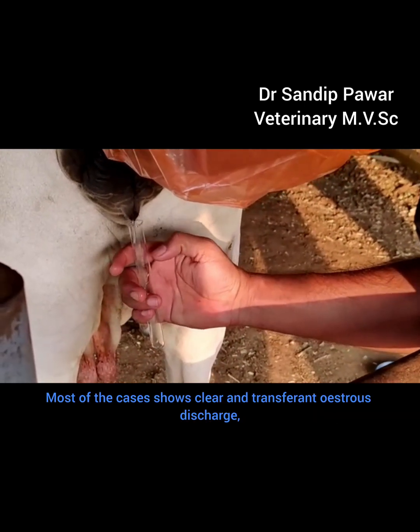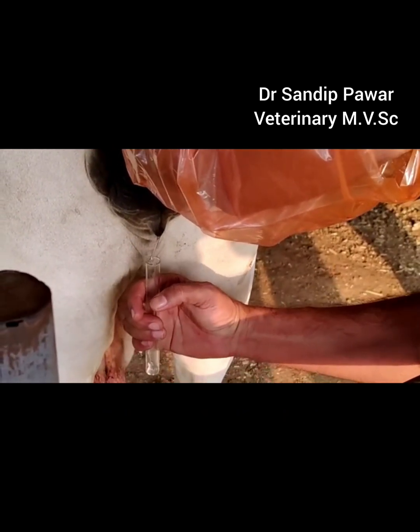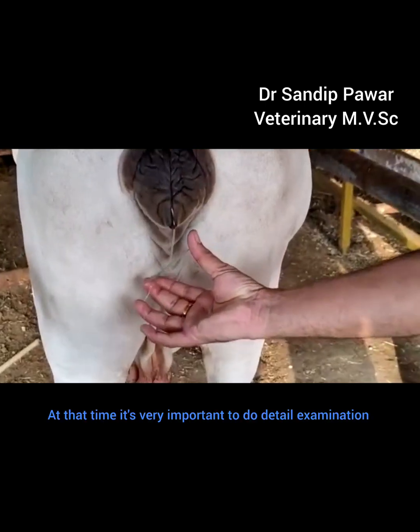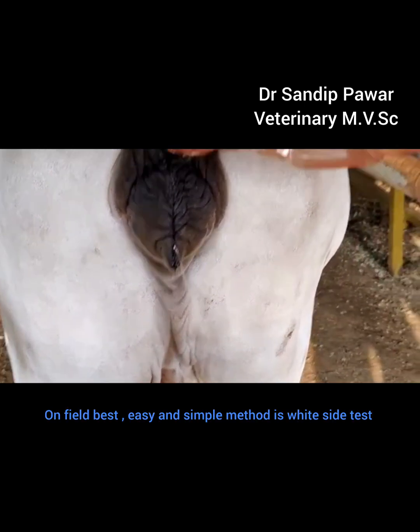Most cases show clear and transparent estrus discharge with cyclic heat and good health condition, but there is a repeat breeding problem. At that time, it is very important to do a detailed examination. On the field, the best, easy and simple method is the white side test.